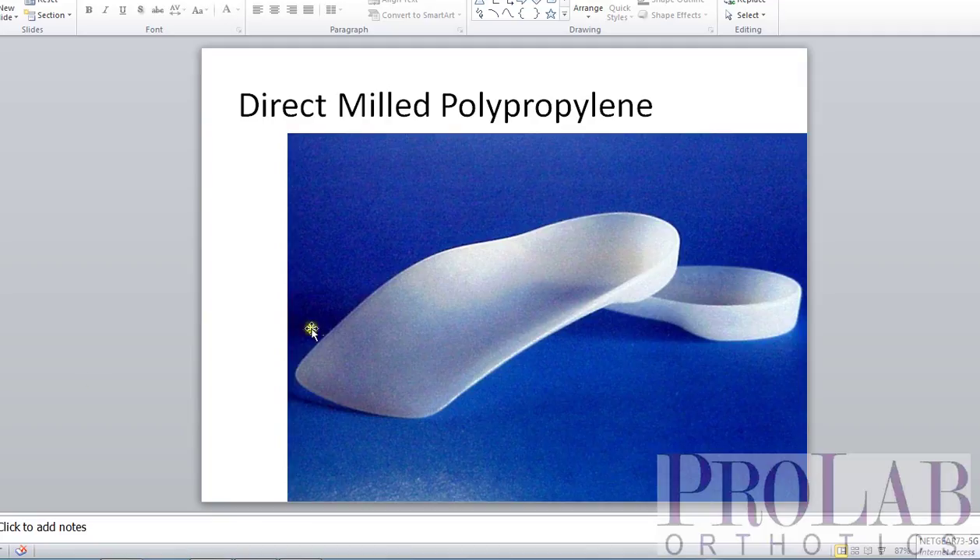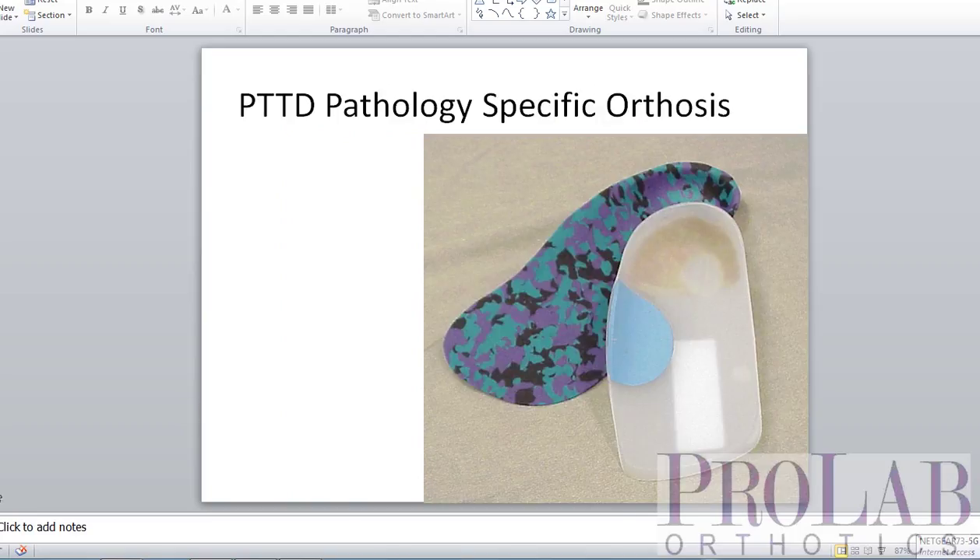There are a few things that you can do with the vacuum-formed that you can't do with the milled. For example, if you want to put a sweet spot — this is a pocket in the orthosis that is then filled with soft material — into the device, we really need to do that with a vacuum-formed orthosis. The other thing: if you want to put in a plantar fascial groove into the shell of the orthosis, then we want to do that with vacuum-formed.